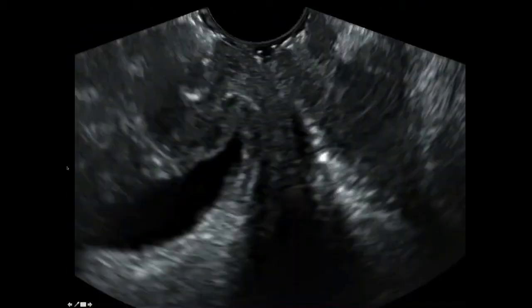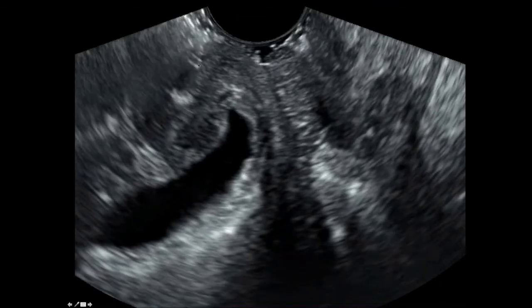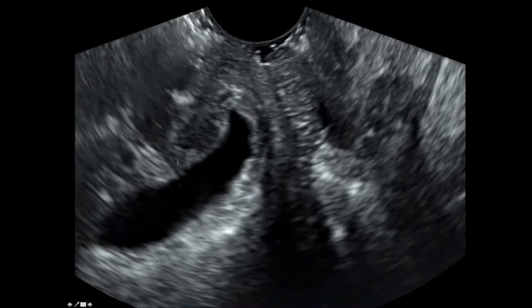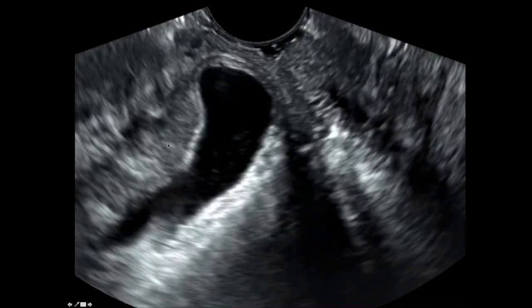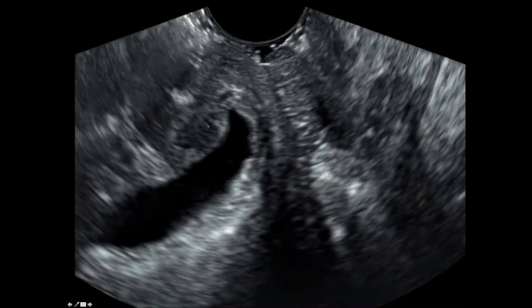So let's see what happens when she actually valsalvas all the way. Sling is down here. Let's see what happens. Sling is here. She valsalvas. No good. The urethra becomes horizontal, and the bladder goes into the vagina.